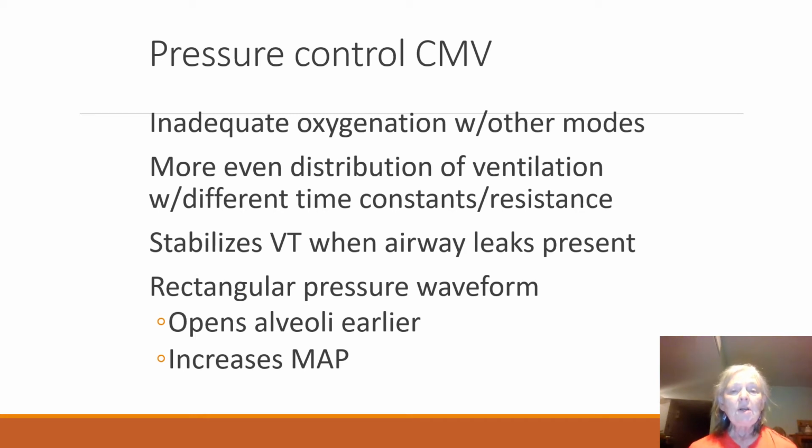We also get more even distribution of ventilation with different time constants and resistance. It stabilizes the tidal volume if you have an airway leak. And the rectangular pressure waveform, as we said, opens those alveoli and it makes the oxygenation much better for our patients.